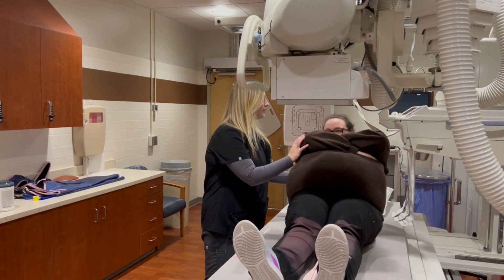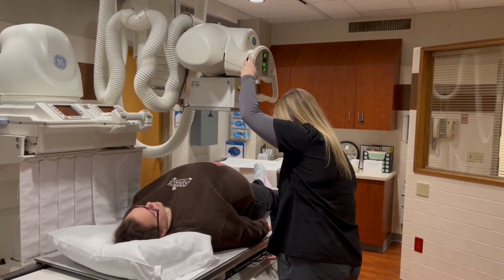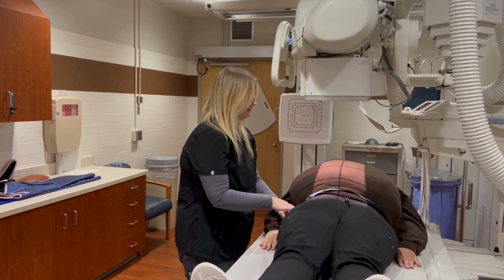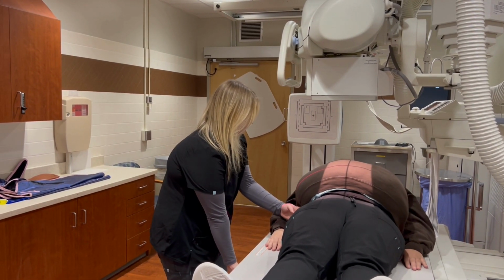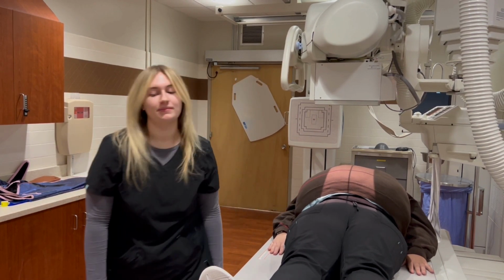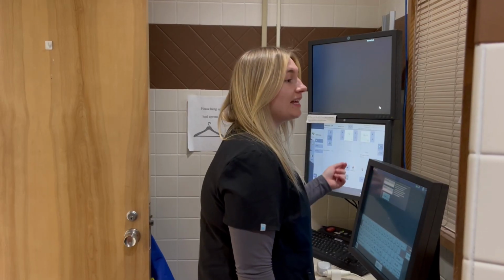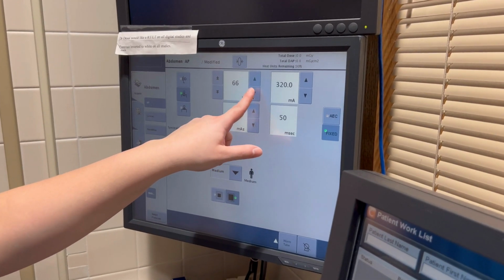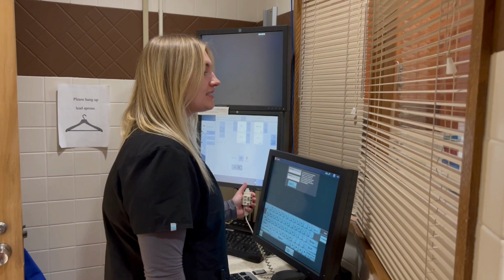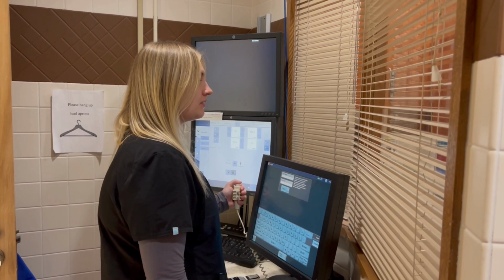Alright, Ms. Jackson, I'm just going to have you lay back for me. Put your hands down by your side. I'm just going to do some poking at your hip. And then I'm going to give you some breathing instructions, and I'm going to set some stuff up back here. You want me to breathe now? Just stay like that. I'm almost done back here. All right, Miss Jackson, I want you to take a big breath in, blow all that air out, hold it out, don't breathe. You can breathe.